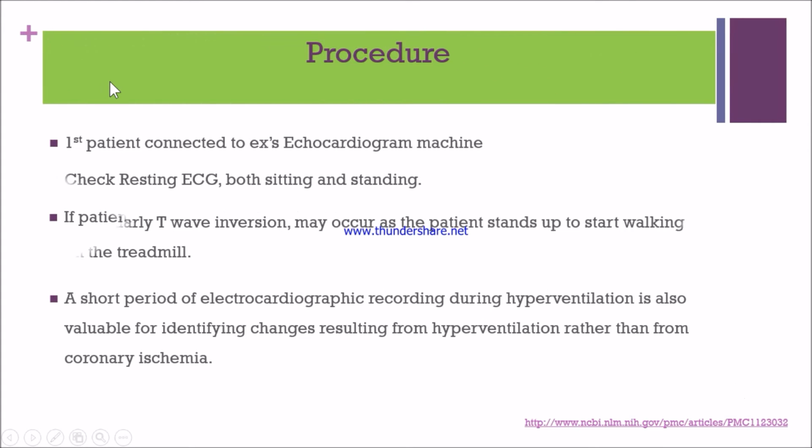See about the exercise stress testing procedure. First of all, we need to connect the electrocardiogram machine to the patient and check the resting ECG in both sitting and standing positions.